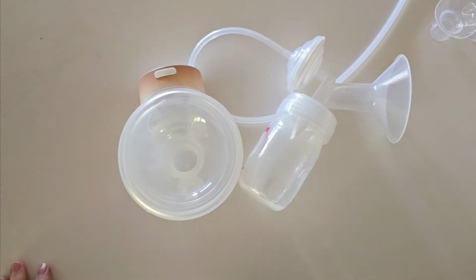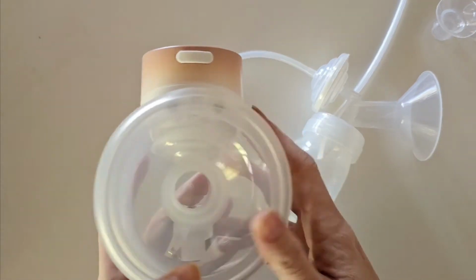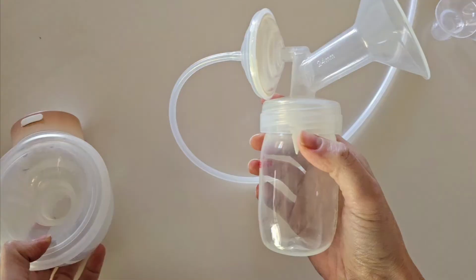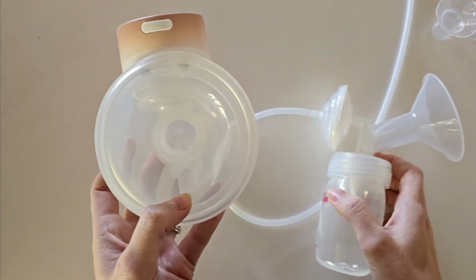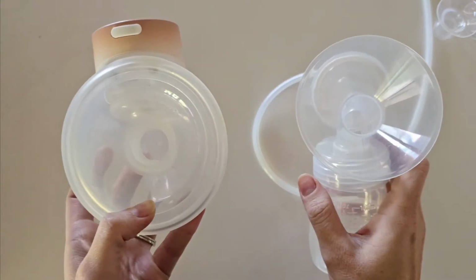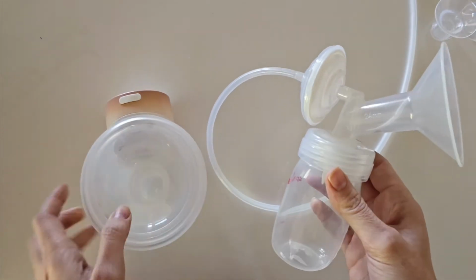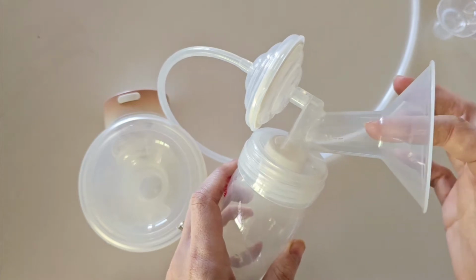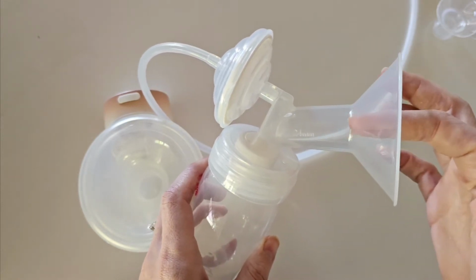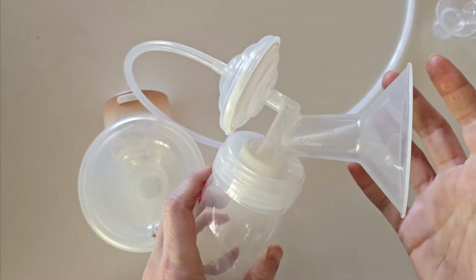One of the most common questions I get asked is, how do you find your flange size? So let's talk flanges. There are different types of flanges. This is off the Spectra. This is the Mum Cozy S12. Now you can see that these are quite different flanges, but essentially they do the same thing. They are designed for your nipple to go in and out as it would in your baby's mouth, and to help create that suction and draw the milk out.